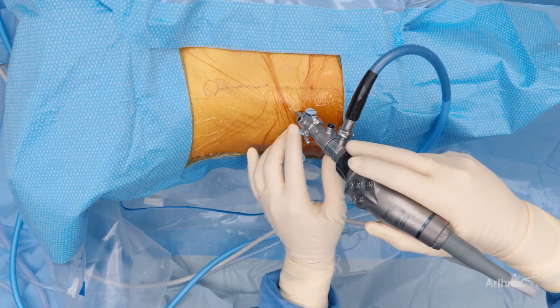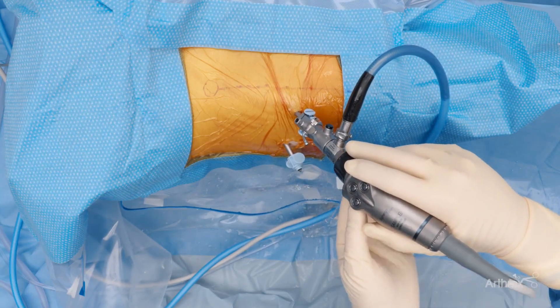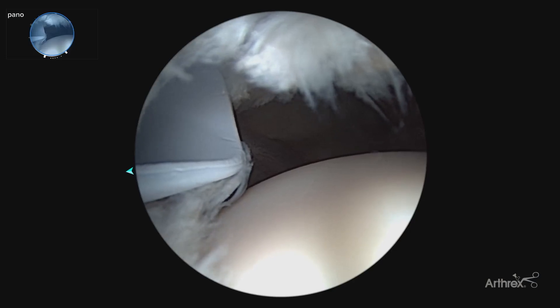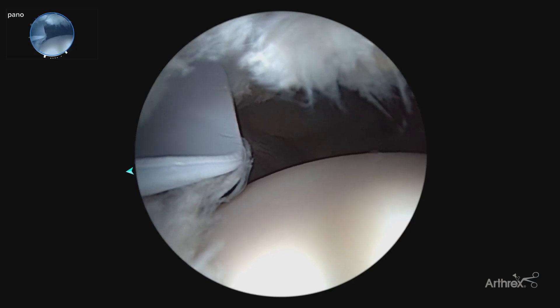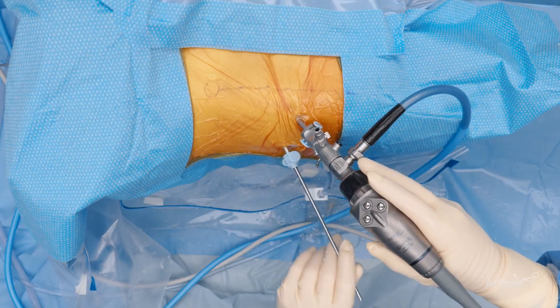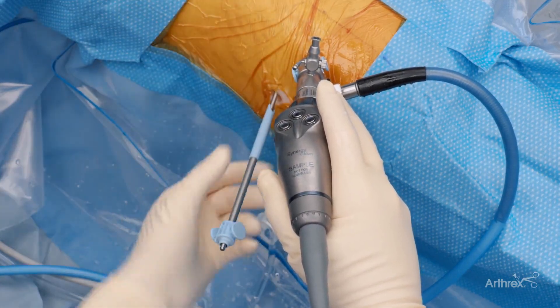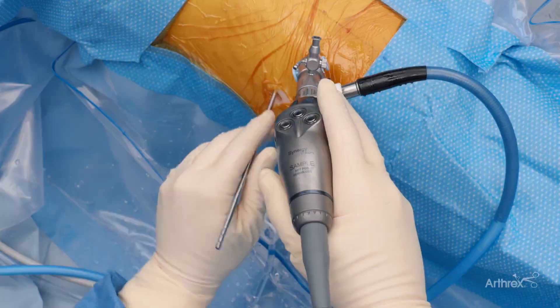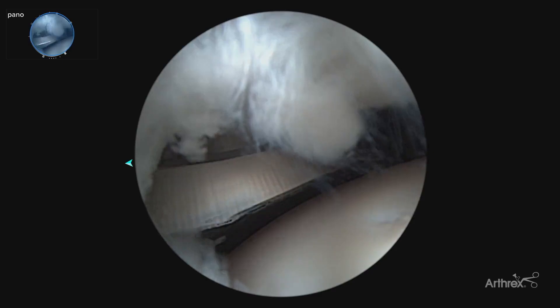Here we are performing hip arthroscopy on the right hip. We've got our anterolateral portal and our mid-anterior portal created. Currently we are viewing through the mid-anterior portal and looking back at our anterolateral portal. We are now going to start performing our interportal capsulotomy. Here we are going to show the new Safe Cut Capsulotomy Blade, and now we can remove our cannula safely with the blunt tip in the joint that protects the cartilage.